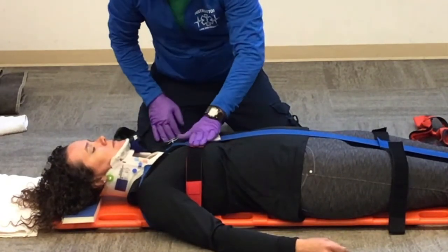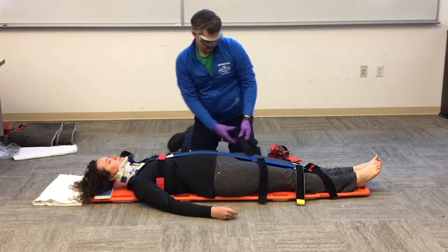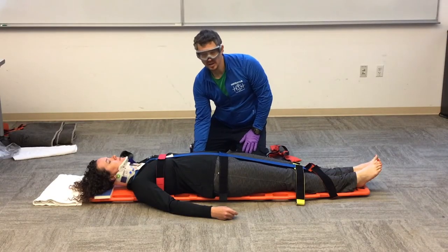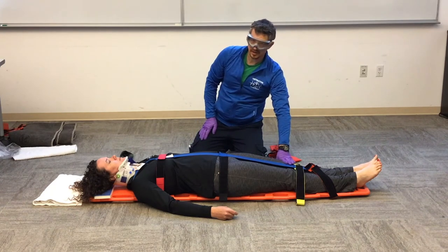So Holly, does that feel like it restricts your breathing? No. We want to make sure that we have padding for our patient underneath the small of their back and underneath their knees.